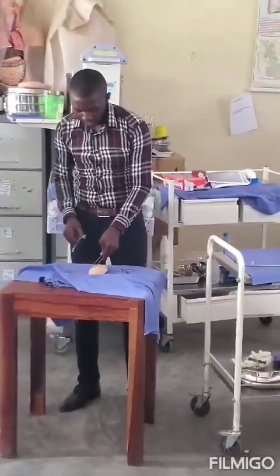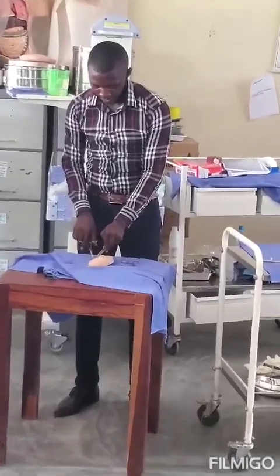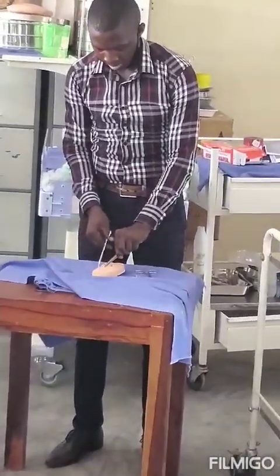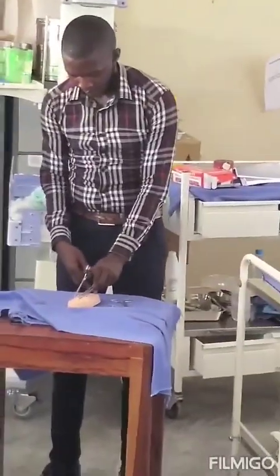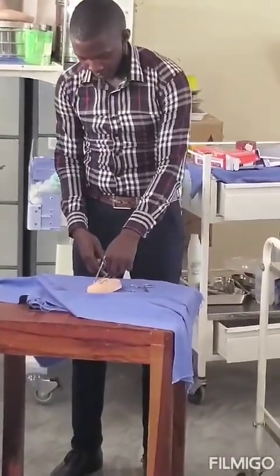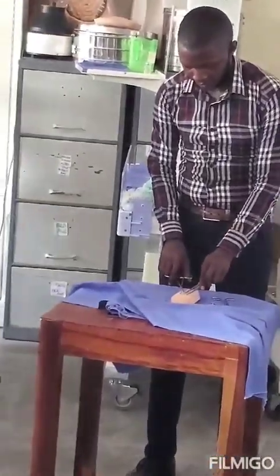So you will hold one edge like that, puncture the edge of the wound, and then with this forceps you are going to pull this side.